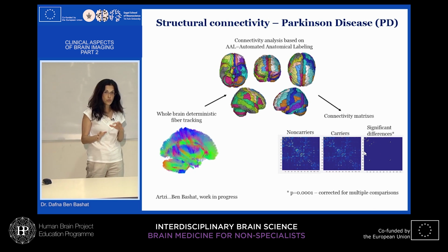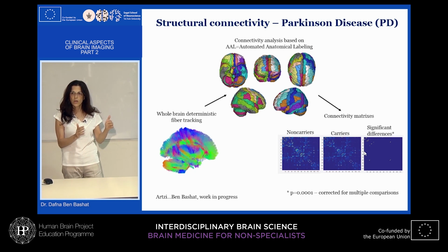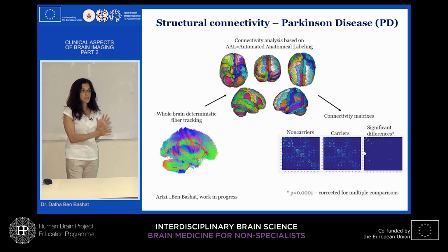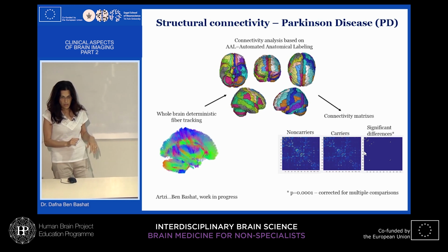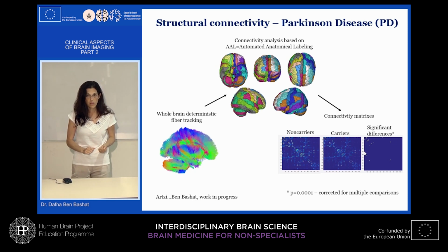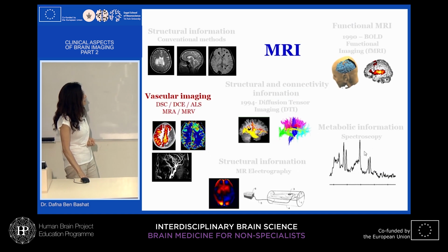We did another study with the dopamine receptor with SPECT imaging, and we have initial results because they have longitudinal studies. We know that if we take those carriers and say, okay, they are different from healthy, their brain looks more like Parkinson disease, and after 2-3 years they converge and become Parkinson, then we can go back and say, okay, this was early diagnosis. And currently we have 2 converters that in retrospect we could identify would develop the disease. So pushing all research is really for clinical needs, daily clinical needs.